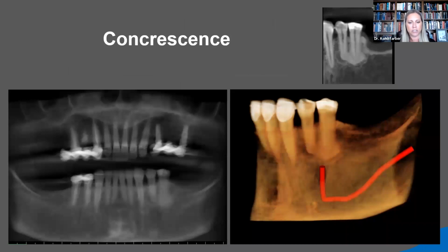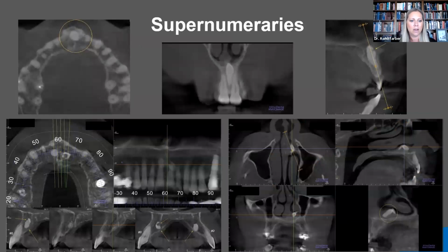I know when I was a general dentist in private practice, one of the partners was doing serial extractions on a 12-year-old female for orthodontic purposes. And he's struggling to get out those first premolars. And all of a sudden 2 teeth popped out. So it was like 2 for the price of 1 day. What happened? There was concrescence, and it wasn't picked up from the 2D images. So if you're going to do serial extractions, you might want to have a CBCT.